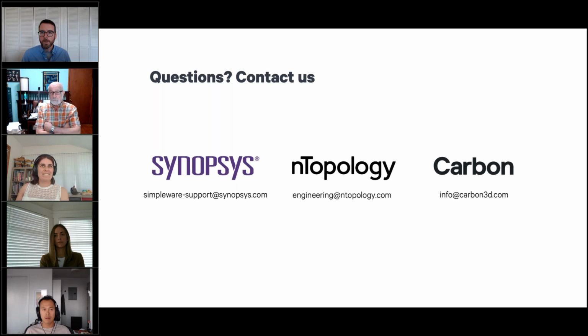Christopher, would you like to comment on patient data and certifications? Yeah, absolutely. In terms of patient data, everything is done locally. There's no computation that's done in the cloud. And also, in the same vein as Synopsys, whatever node or terminal you're processing on, it's going to be isolated to that black box, and no patient data will leave that.